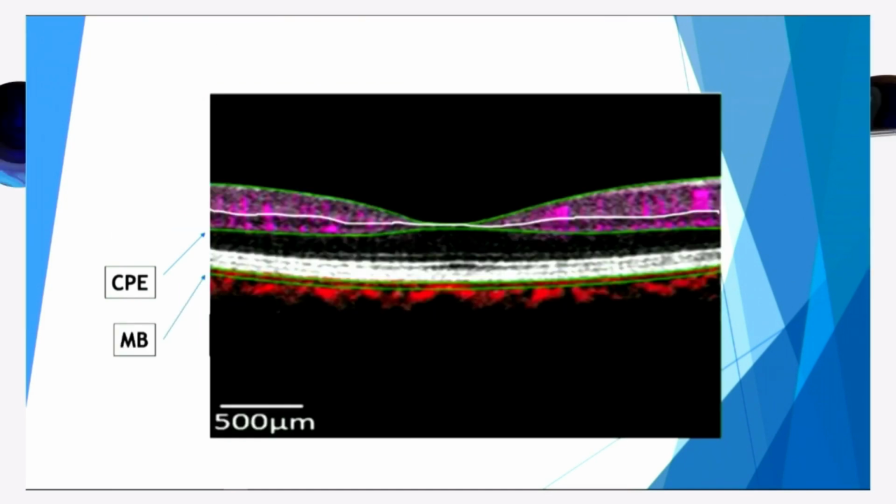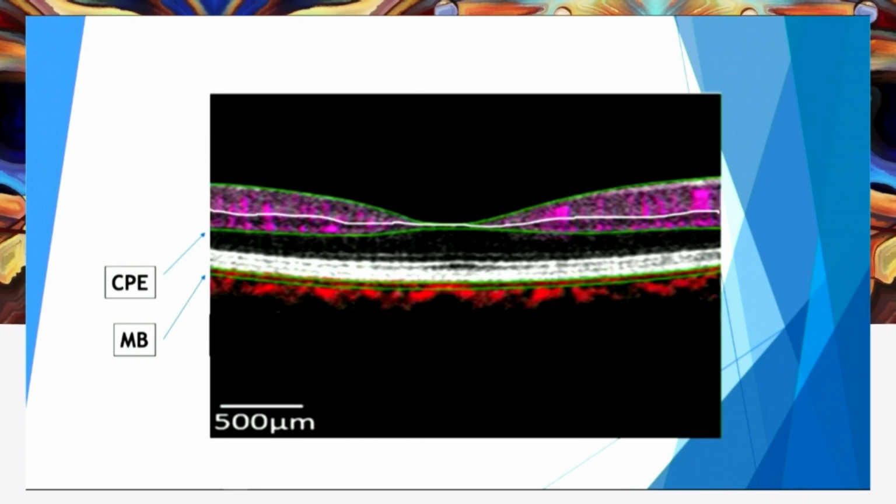plexus. When we segment the external plexiform layer to the Bruch's membrane, this is the external retina that is avascular. Then we will have this black image. There's a few details that you can see here. This is gray, and this refers to a number of problems that machines can have, and we will talk about this in more detail later on.